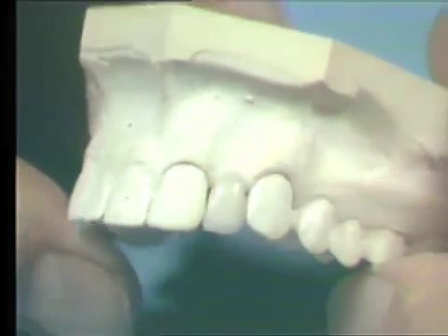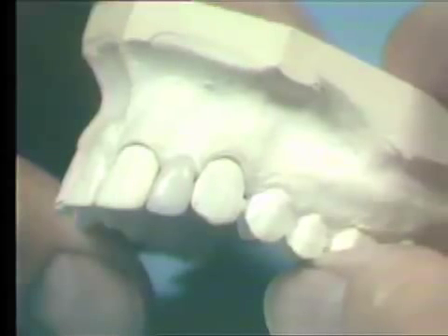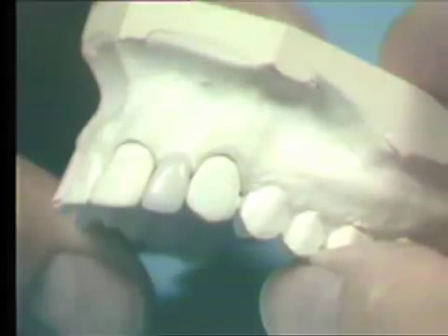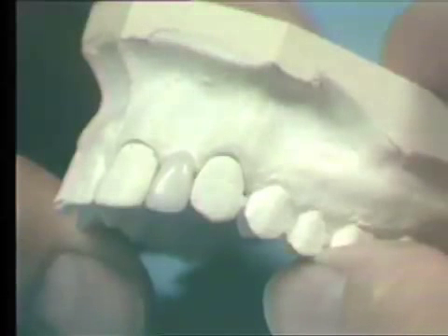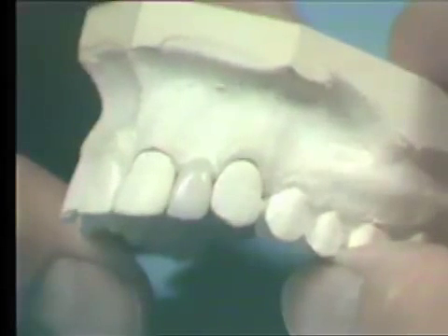The surface of the porcelain must be absolutely clean prior to the application of the stain. Clean the pontic for a full five minutes in distilled water in an ultrasonic cleaner. After it has been cleaned, do not handle the ceramic surface with the fingers.